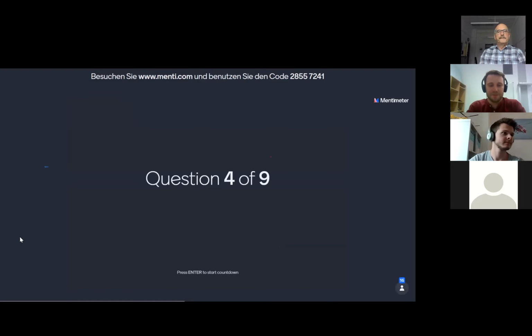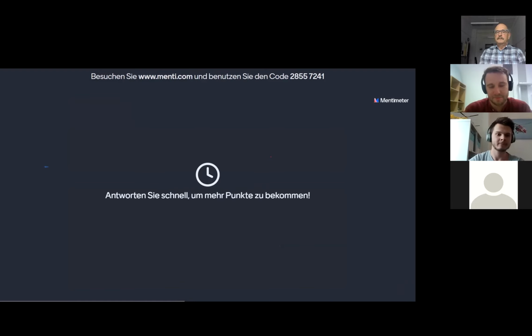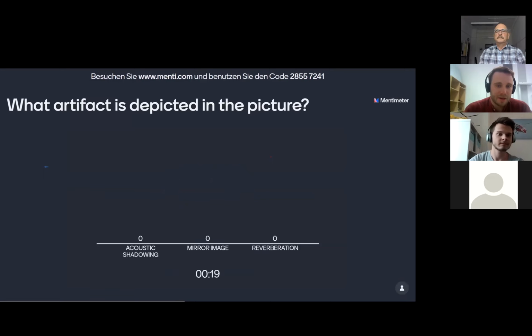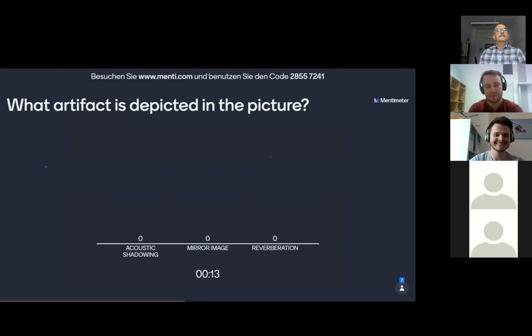And now the question. We're not looking for the pathology, we're looking for the artifact in the picture. It's a beginner question, but yeah. Acoustic shadowing. No spoilers, please.